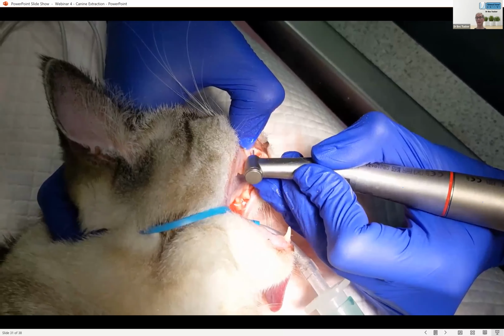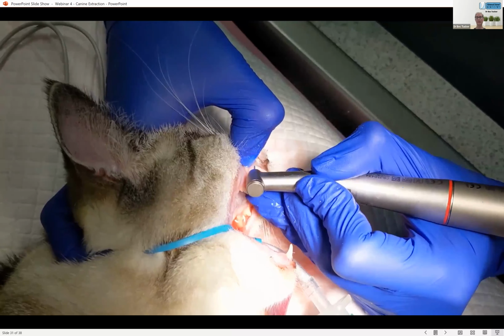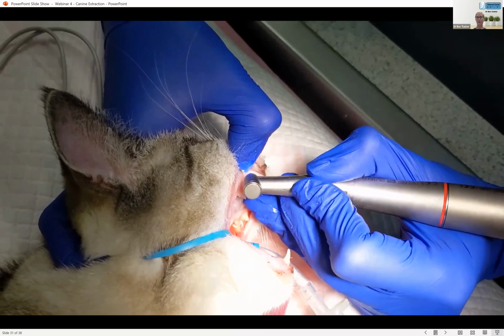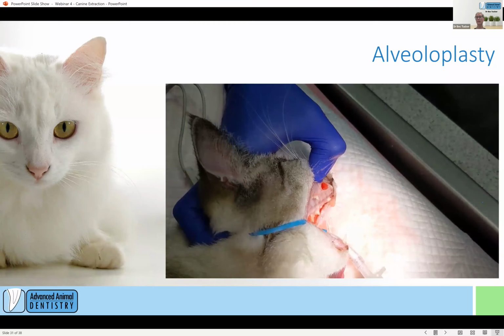You've got to be super careful in the depth of penetration of your needle. I will literally just put it in so the bevel is through the tissue, no deeper. And always draw back beforehand. But there is a risk of orbital damage. I think all blocks in cats, unfortunately, with maxillary carry some degree of risk, infraorbital included. If you insert into the infraorbital canal, the orbit is literally just behind that. So I guess the take-home message is you'll hear lots of pros and cons about each one. Do what you're comfortable with and just be really careful. That's the big asterisk to it. Certainly the caudal maxillary block and the infraorbital block, neither of them are immune to causing damage to the orbit.